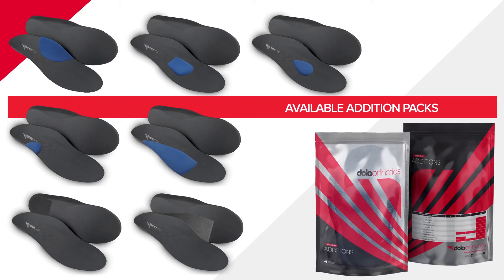Complete your Dola Pro with a customised top cover and dispense. For a complete range of EVA and pre-made additions, please visit dolaorthotics.com. Follow us on Instagram and Facebook for the latest news, education and training.